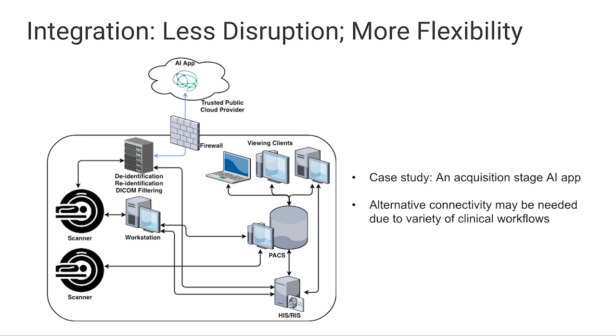This way you form sort of like a local loop between the scanner and the DICOM node, the vendor's DICOM node. Or sometimes it could be the workstation and the local DICOM node. But in both cases, you basically have a branch out of your clinical network and does not really affect any other things that's happening on that network.